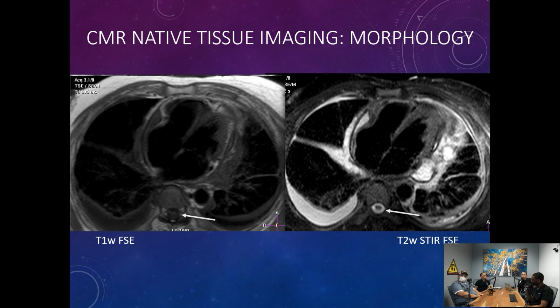We do breath hold instructions for most of the sequences. So I'm a cardiac scanner myself, so I do hearts. And another thing that we do is we call it gating. So we'll set you up with some ECG leads and we just kind of compensate.